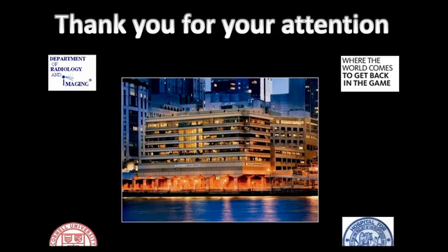If you look at all comers for people who get imaged with MRI, it's a very small proportion where the load-bearing one is going to make a difference. That's why I like having the upright radiograph. Of all the MRIs that I'll be reading, it'll just be a small percentage where I have that upright radiograph where I can make that call.